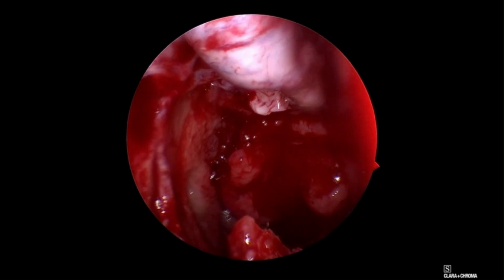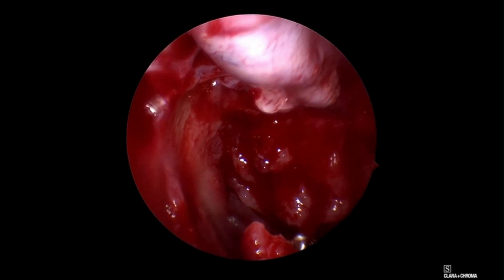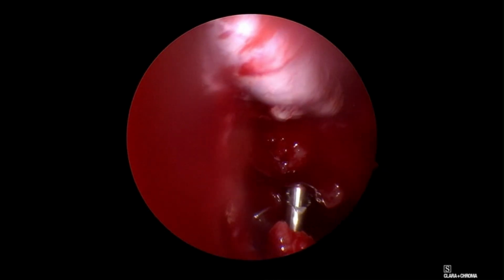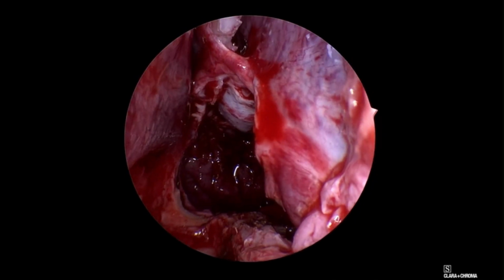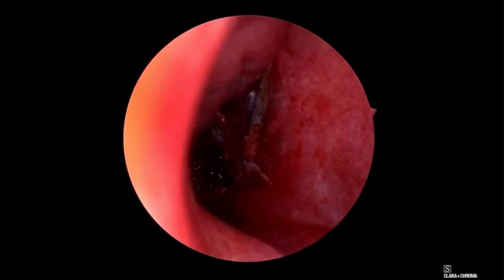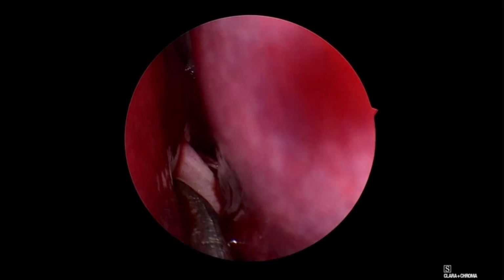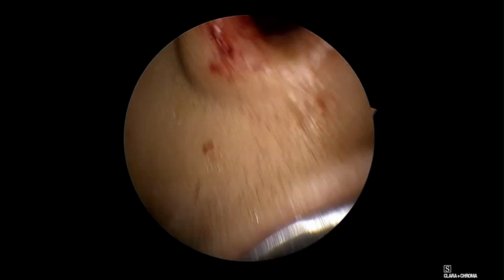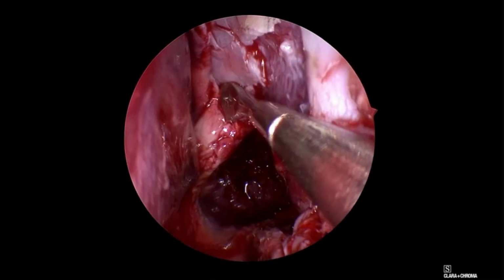I did an adenoidectomy with a microdebrider. I've not tried to be too radical with the adenoidectomy. I have replaced my superior base pedicle flap over the raw bone, while the inferior base pedicle flap has been utilized to cover the floor.